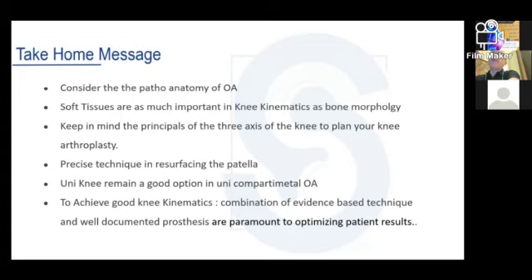It is constrained in the medial part, and the lateral part is almost unconstrained, and there is almost no flange in the Medacta procedure. There is a very, very thin posterior flange. It is almost flat in the lateral part, but in the medial part, it is constrained. In the mobile resurfacing, you can have both plateaus constrained, but it gives you more mobility in rotation. It's not the same concept.